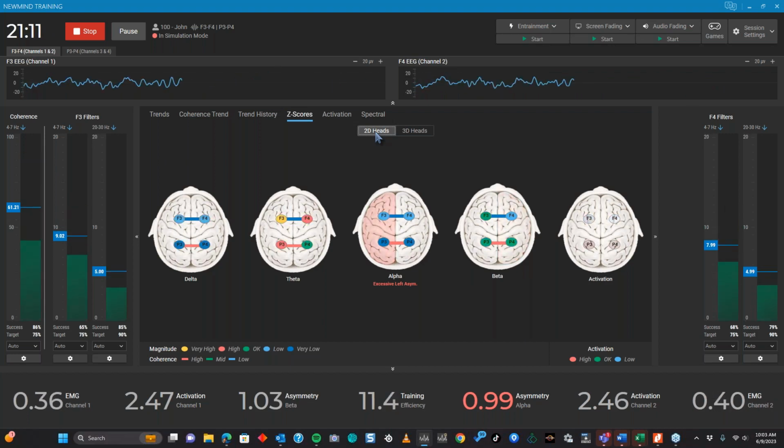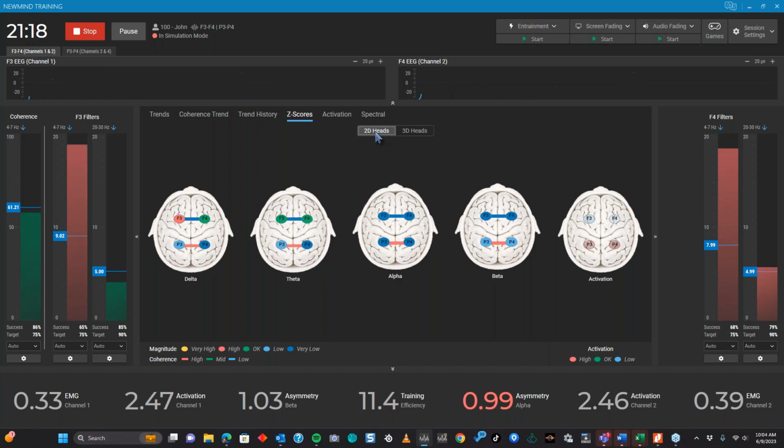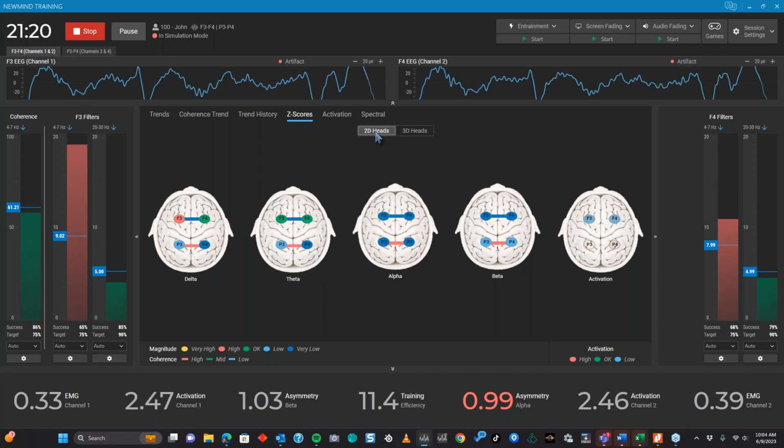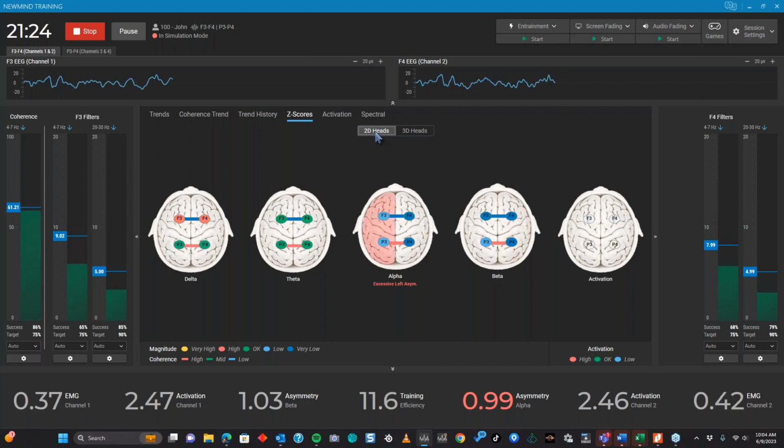So that's why we also always recommend mapping them in the mornings, so we're not getting them at that sleepy part of the day after the circadian rhythms kicked in. That way we're going to get the most accurate outcome we can get.